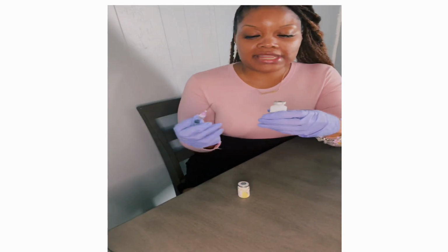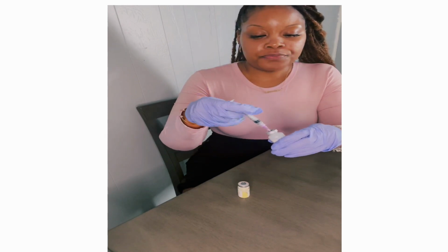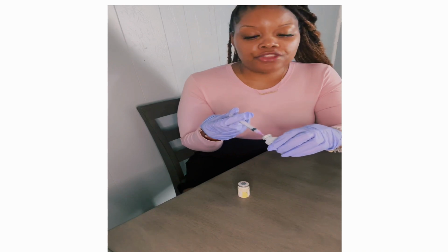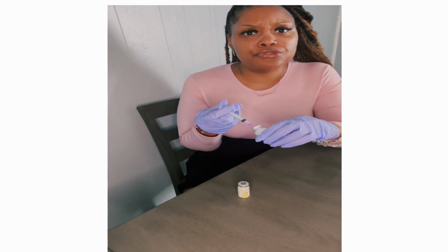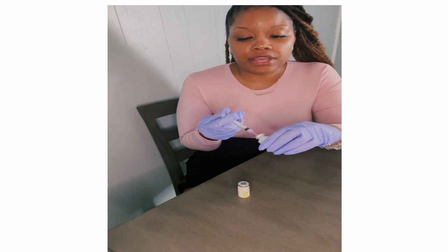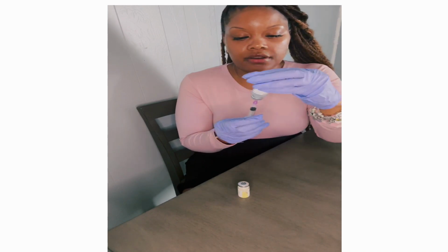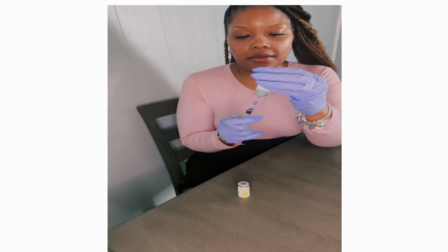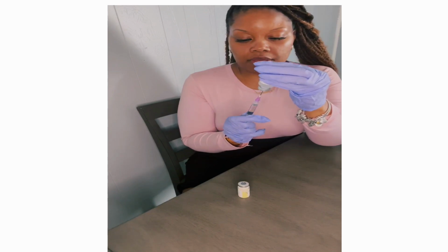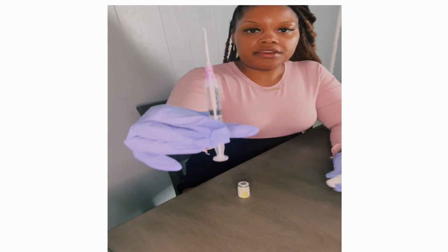So then we're going to go inside our sterile water, and we're just going to inject the air inside our sterile water. So you guys remember that you're injecting air in here just so that you're able to pull back the medication. So let's say you skip this step. Will the medication come out? Yeah, sometimes it will, but sometimes it won't. So just a rule of thumb, just make sure that you're injecting air. So then we're going to invert, and then we're going to pull back our 2.2 mLs of sterile water. Okay, and there it is right there.